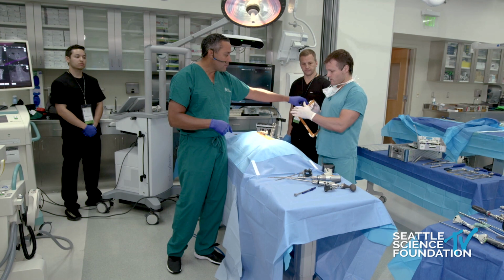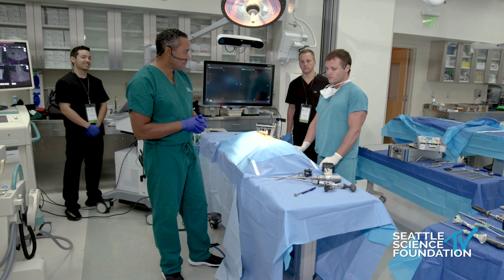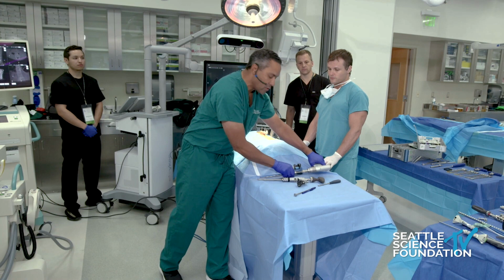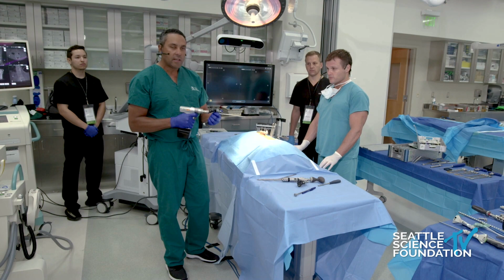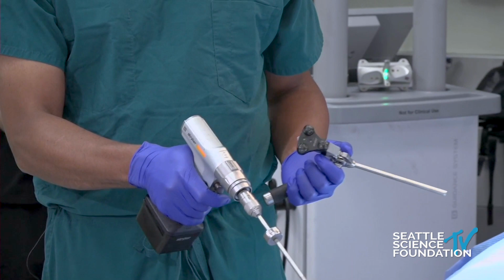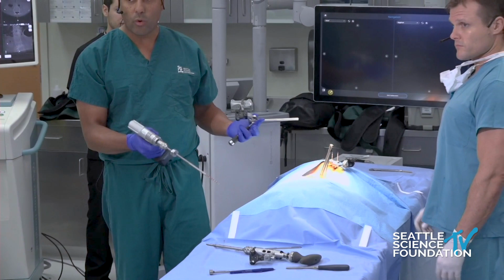And one other question. David, I don't have as big of biceps as you or Zach, and in turning in the screws, right? If you're doing 2, 3, 4 levels, would you ever consider putting the screw in under power instead of doing it manually? Yeah, we only had one power drill, and so I chose to use power for the drill bit. Because I think you actually have a little bit more control with power, and then I would have put the screw in under power as well. But we only had one power system. Got it. So I would do this with two power systems: one for the drill and one for the screw. Or I would use a single pass screw system and power it.